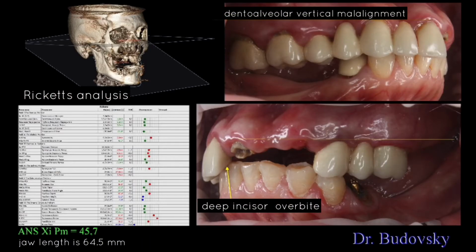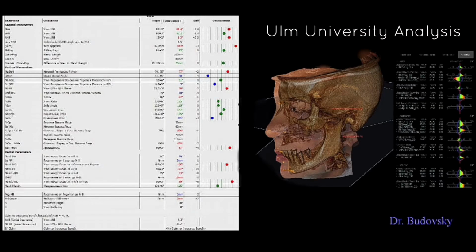Next, calculations are carried out for cephalometric analysis, that is, we analyze the skeletal parameters of the patient. The fact is that when we look in the oral cavity we can focus on the teeth, but patients came not only with some old teeth or broken teeth, sometimes they came with no teeth at all.